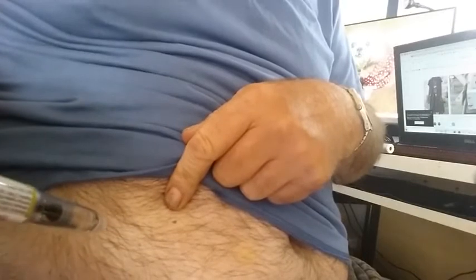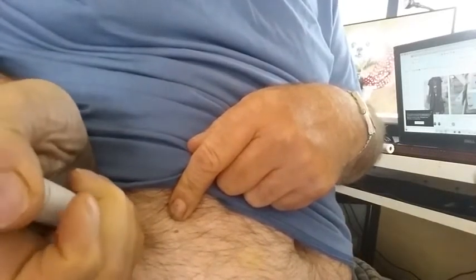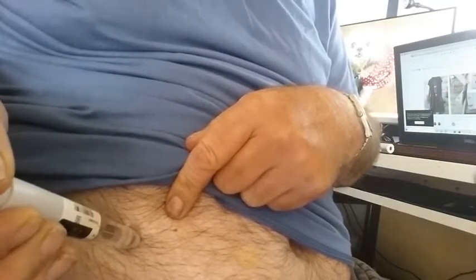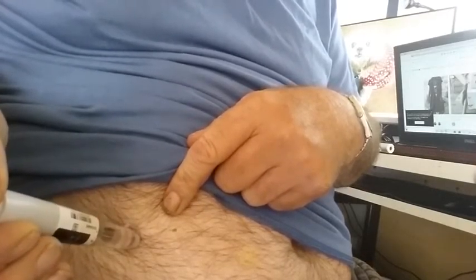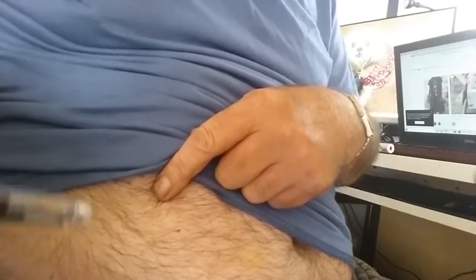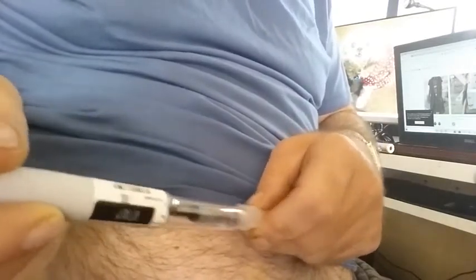I don't want to get into all the measurements right now, but I'll just stick that in there, and you just make a straight poke. Inject the drug, and it'll stop. And then, this is key, I think, you leave the needle in there. I was told by a doctor once, leave that in there for a few minutes and make sure that all of the medicine seeps out from the needle into your skin. And then you can just pull it straight out, and you're done.